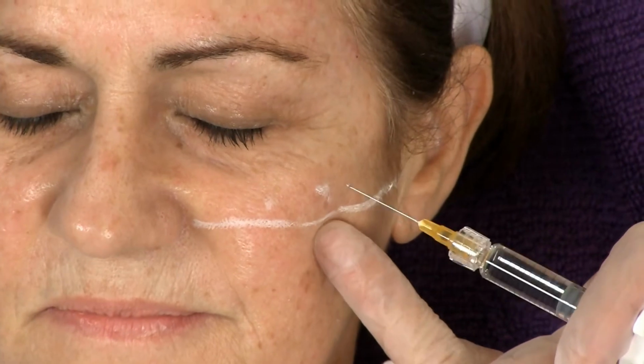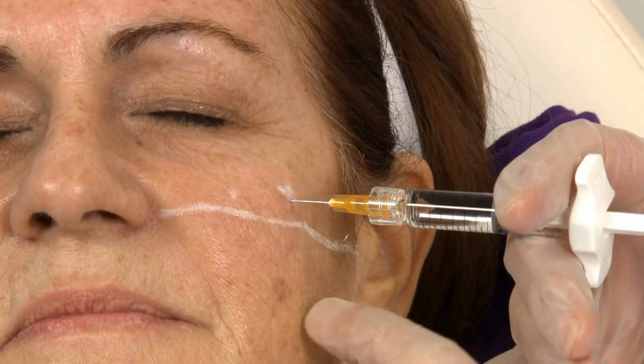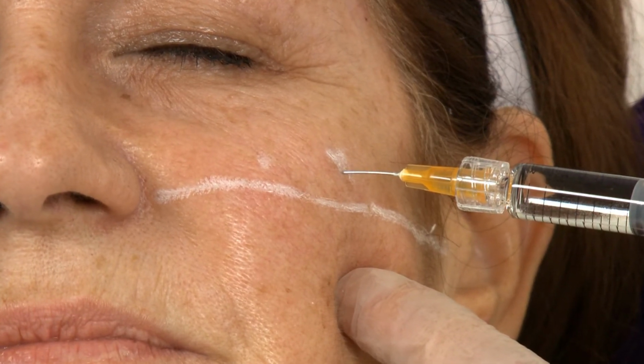Insert the needle at a 90-degree angle into the supraperiosteal plane of the skin and place a microbolus. Mold away from the infraorbital foramen. Be careful not to force pressure on the plunger, making a large aliquot.